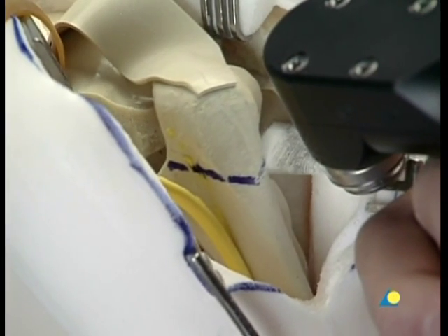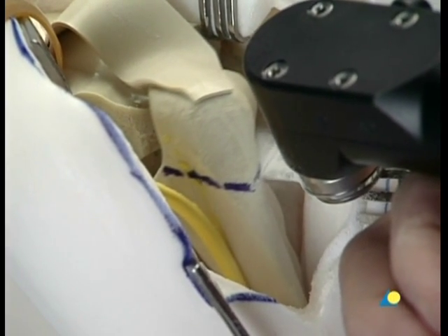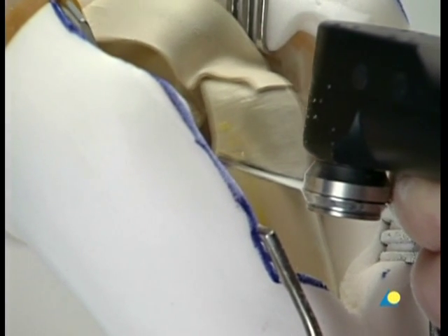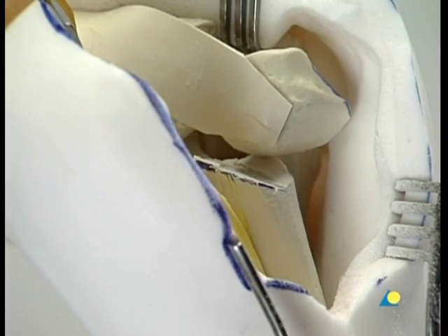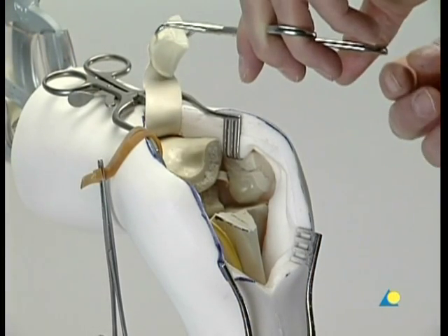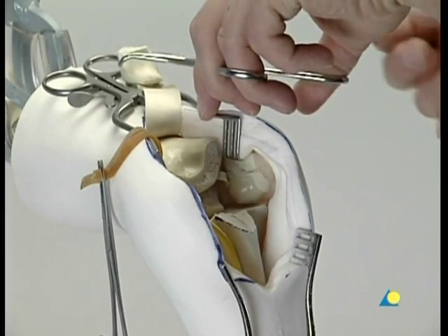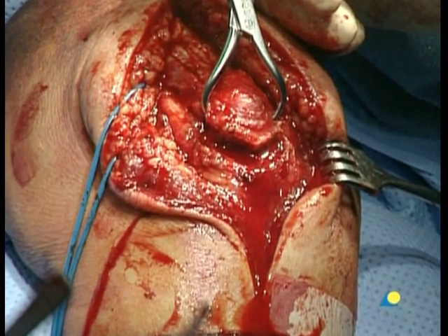The oscillating saw is used and the bone is cut almost completely across. The separation is completed with an osteotome to avoid a loss of substance at the articular level. For the exercise, the osteotomy may be completed with the oscillating saw. The cut tip of the olecranon is elevated and reflected. If any foam enters the fracture, it should be gently removed in the same way that fragments are cleared from hematoma. The fracture situation is now assessed and the reconstruction started.